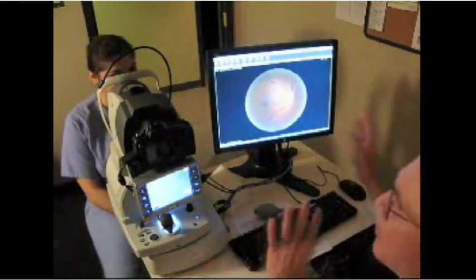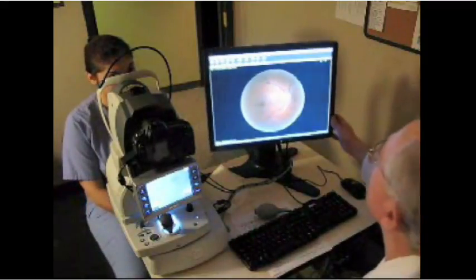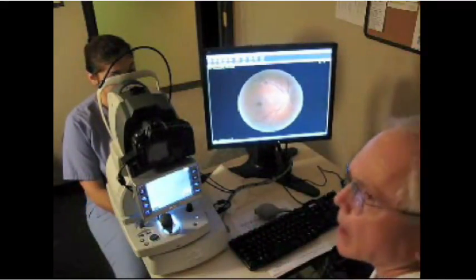Naturally, I would have shot both eyes, but this is the way that we screen for the retinopathy.